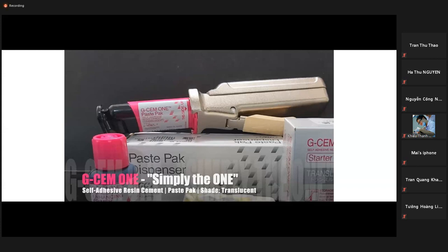Và tiếp theo thì chúng ta sẽ bôi cái G-sem xi măng này vào mặt trong của chụp và chúng ta sẽ để khô vậy thôi chứ không có chiếu đèn. Yeah. So for lithium disilicate we need a silane to pre-treat it.